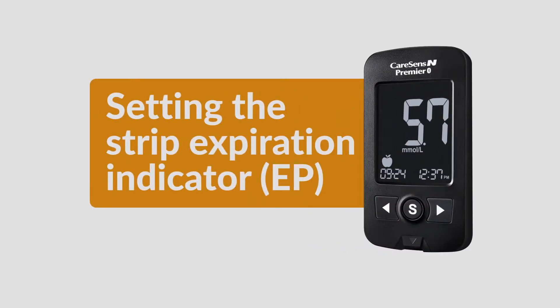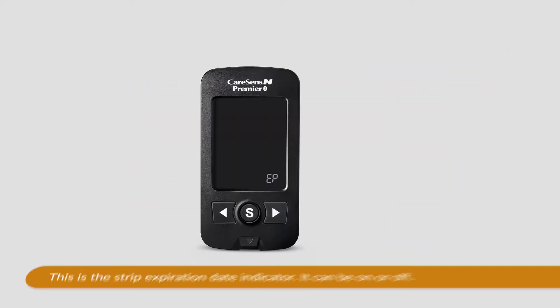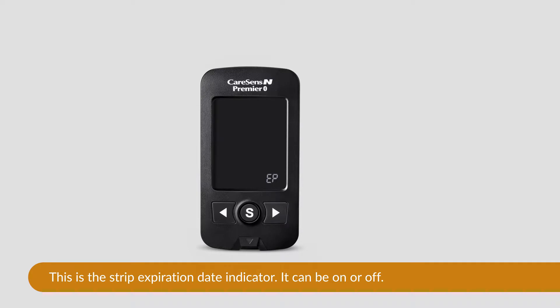Setting the Strip Expiration Indicator: EP will appear at the bottom of the screen. This is the Strip Expiration Date Indicator. You can choose to have the Strip Expiration Date Indicator on or off.